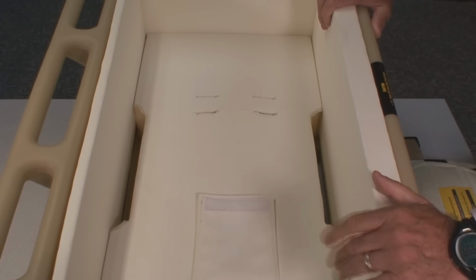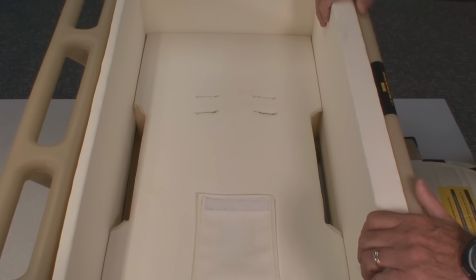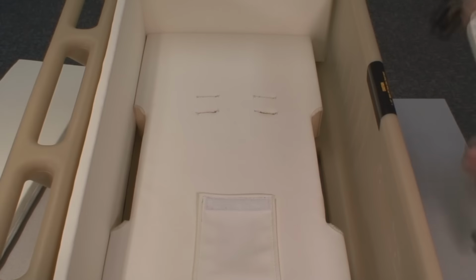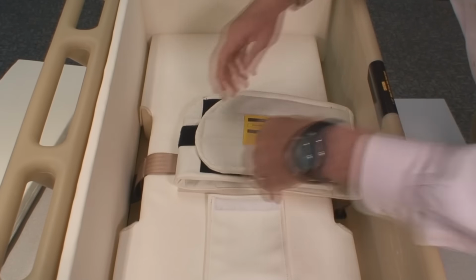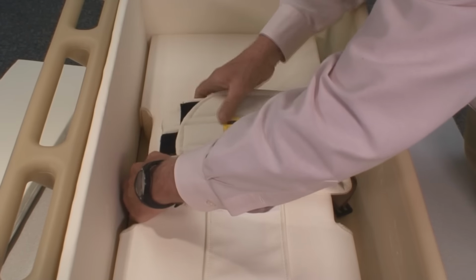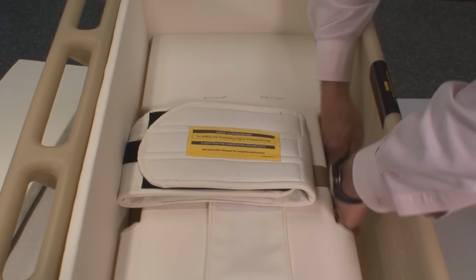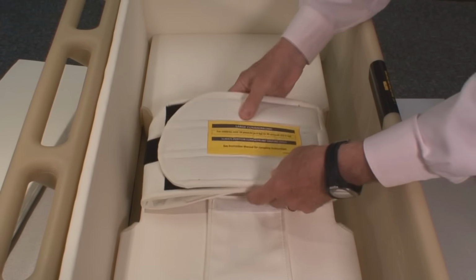We're going to demonstrate how to install the cummerbund and the sleeping bag into the car bed. The first thing you want to do is remove the 1.5-inch side panel. Lay it aside for the moment. Take the cummerbund, lay it in the car bed, move the 3-inch cushion this way, and insert the metal slide into the slot. Once you have the left side in, then you put the other side in. In order to put this metal slide in, you have to compress the cushion slightly. Now you have the cummerbund in.